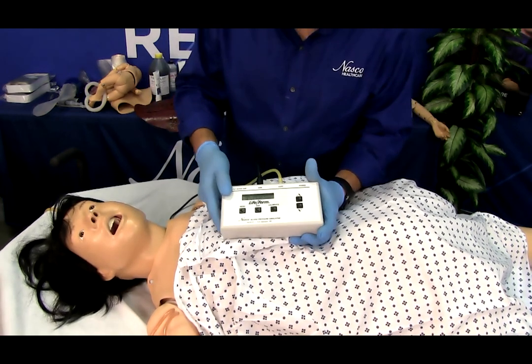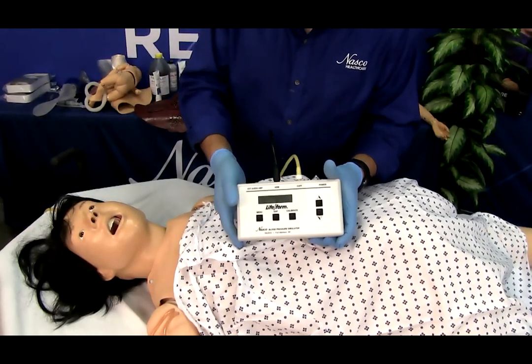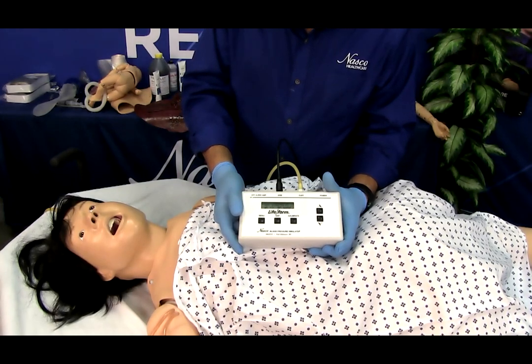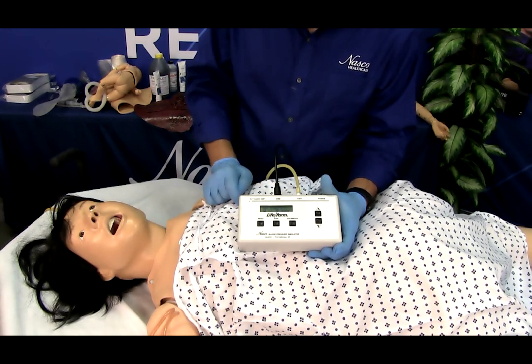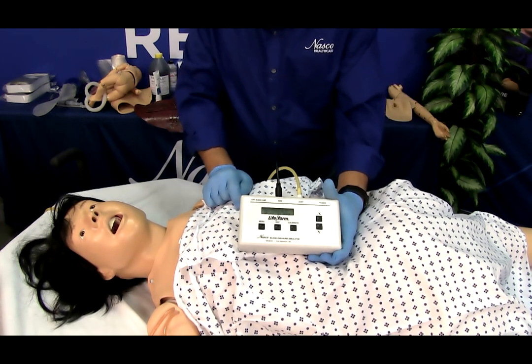Press the menu key a second time. The Set Diastolic Pressure menu will display in the electronic control unit window. Use the up or down arrow keys located to the right of the menu button to adjust the diastolic pressure. The systolic and diastolic pressures can be set anywhere from 0 to 300 millimeters.